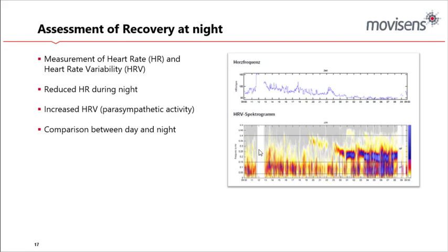Obviously, this is when the sensor's been taken off and it's not worn at that particular time, or probably after a shower, after some exercise, I would say here, by the fact that the heart rate's gone quite high. And then the steady recovery over time after that, and then into sleep phase, you can tell here the sort of steady decline in heart rate and the nice low sort of recovery heart rate until this point here, where you can tell the alarm's probably gone off and they've taken it off again to maybe have a shower or get ready in the morning.